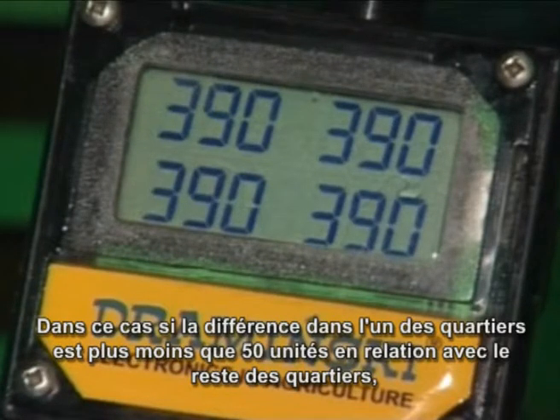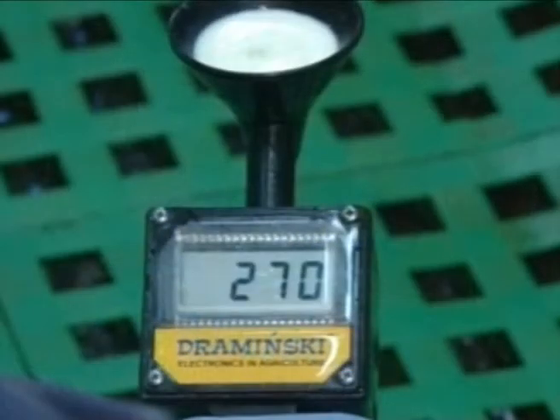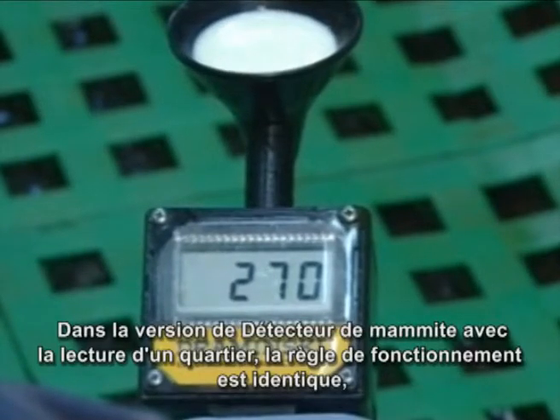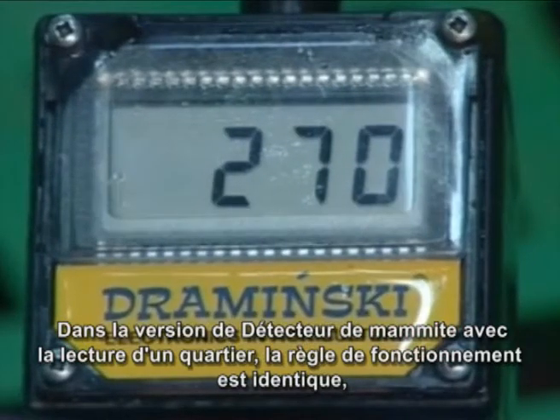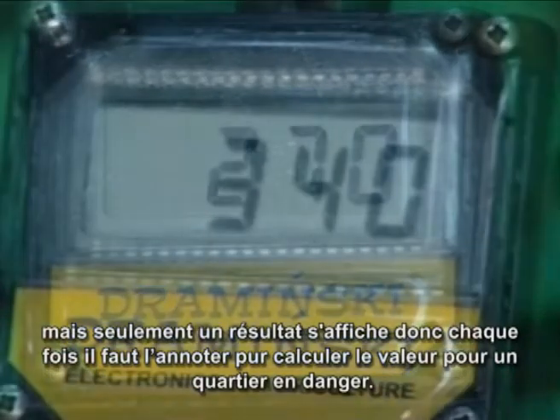Young cows will give higher average readings, but again, if any one quarter is at least 50 points lower than the next, then an infection is present and the quarter must be treated. The single-reading Draminsky mastitis detector performs exactly the same task but displays just one reading at a time.